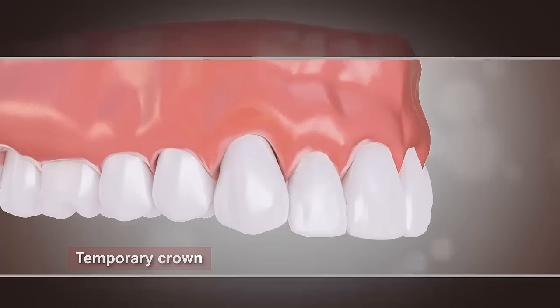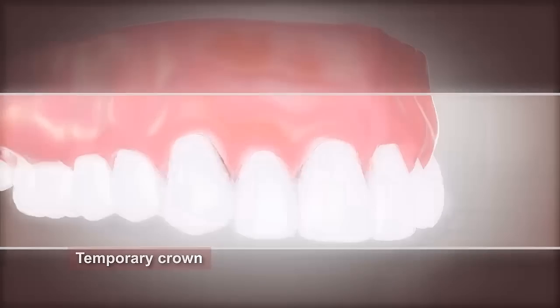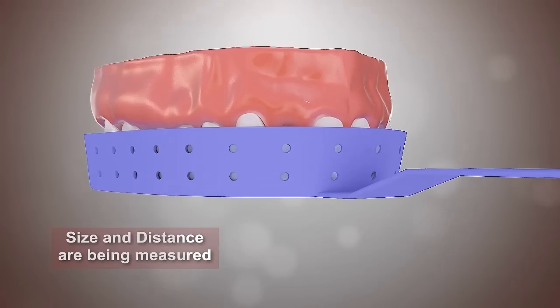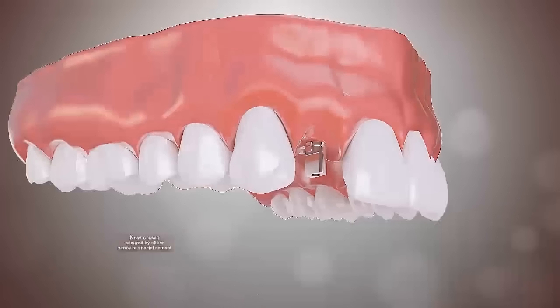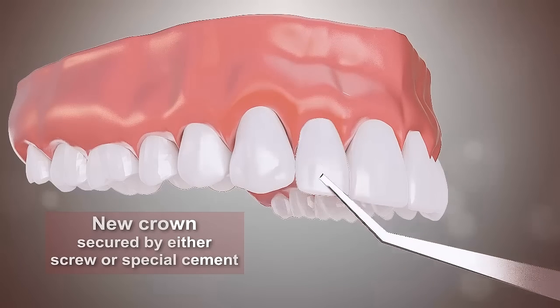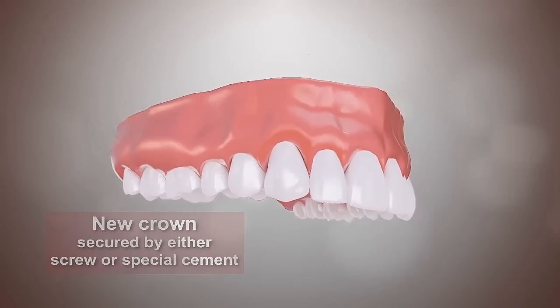The space with the missing tooth can be filled by a temporary crown. To create the permanent crown, a mold is taken of the implant and surrounding teeth, and the color of the natural teeth is examined in order to create a perfect match for the new crown. The new crown is secured onto the implant using a screw or a special cement.